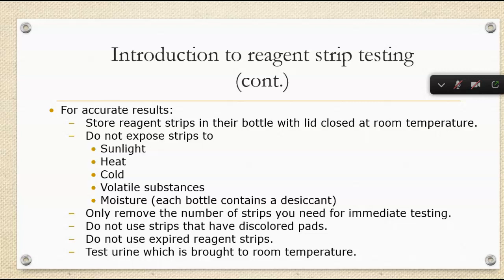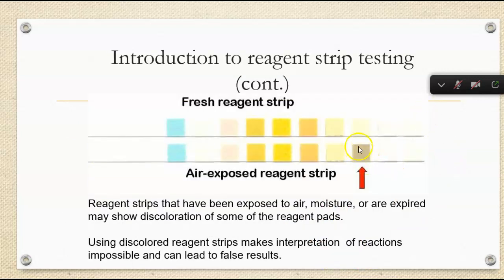A lot of these are enzymatic reactions, and enzymatic reactions are directly impacted by changes in temperature and changes in pH. Enzymes are a lot slower when they're cold, so you may get some false results because of that. This is an example of that brownish color — the air-exposed reagent strip. You want to always check that, and sometimes we can see discoloration of expired strips as well.